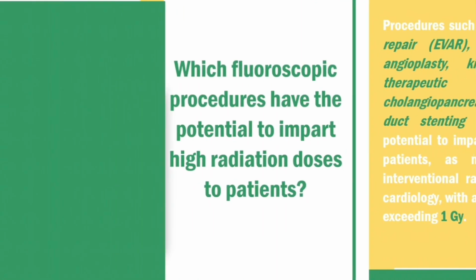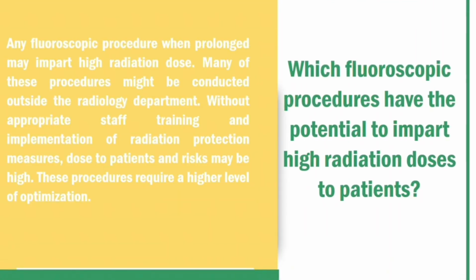Any fluoroscopic procedure, when prolonged, may impart high radiation dose. Many of these procedures might be conducted outside the radiology department. Without appropriate staff training and implementation of radiation protection measures, dose to patients and risk may be high. These procedures require a higher level of optimization.